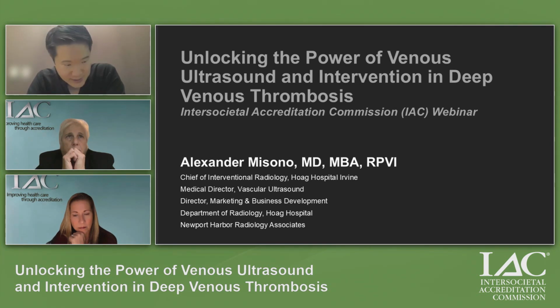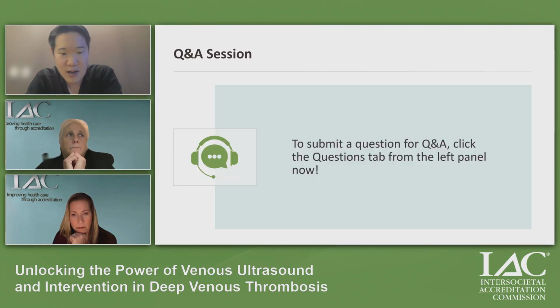One patient has, let's say, very poor cardiac reserve and they have an acute DVT and a tibial clot, or let's say a gastroc vein or wherever, right? Somewhere where there's a little bit more controversy of what to do with that thrombotic burden. That might be a patient, let's say with poor cardiac reserve, really concerned about propagation, bedridden, that you might be thinking about anticoagulation or maybe an IVC filter. Another patient who's young and healthy and got the DVT because of whatever reason, but they're active and able to get around, they can put their compression stockings on. That might be somebody we watch. We would do serial ultrasounds and ensure there is no propagation. And when we do that, by the way, a lot of those patients never propagate.